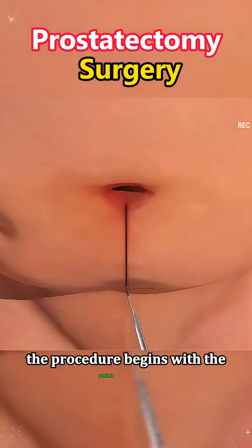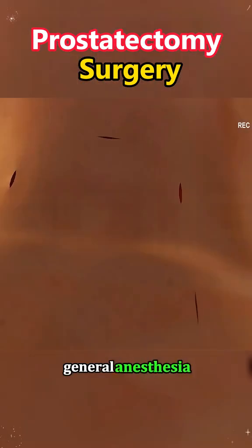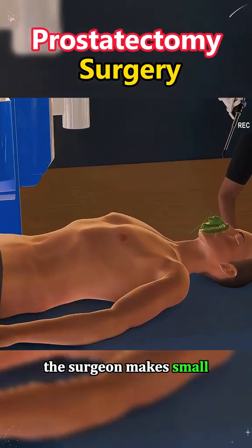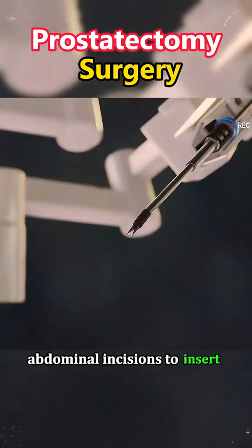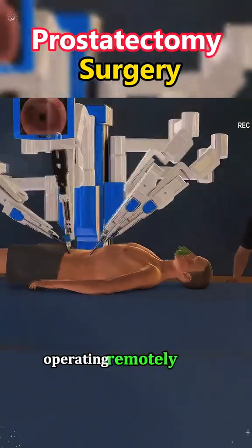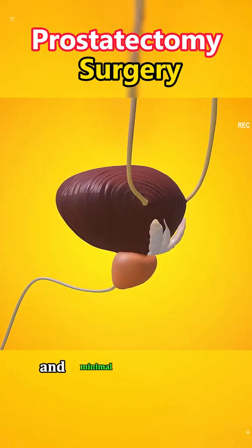The procedure begins with the patient under general anesthesia. In a robotic-assisted radical prostatectomy, the surgeon makes small abdominal incisions to insert instruments and a high-definition camera, operating remotely with enhanced precision and minimal invasiveness.